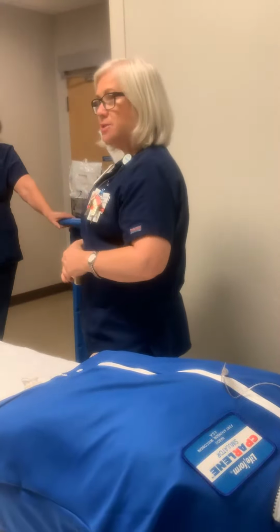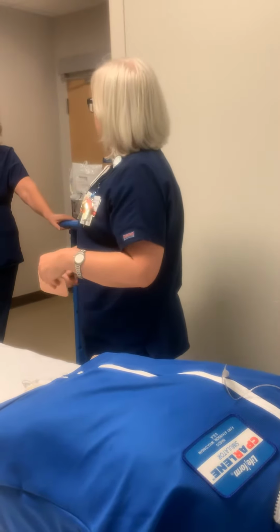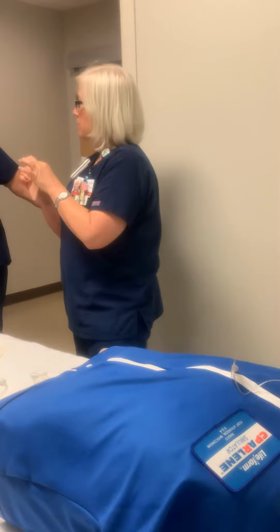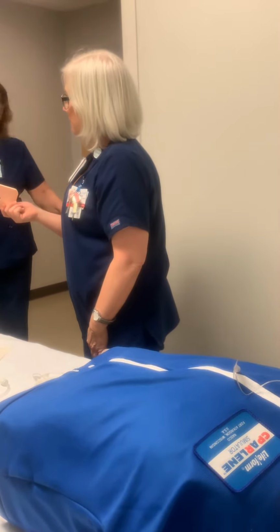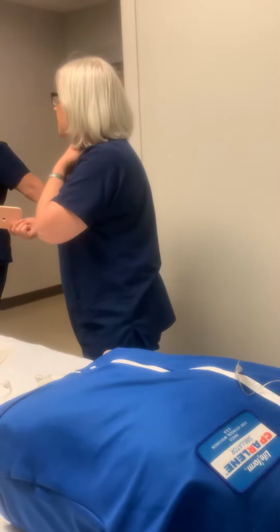We use them on the peg tubes too, because they're bolsters, they're great bolsters, and they prevent that excoriation underneath there. Cool. But the nice thing I like about these is they might seem thick, but they're just incredibly pliable, and they just mold to everything. I just know Dr. Schellenberger, because a patient that comes right now, his trach was super tight. And these are still sutured?